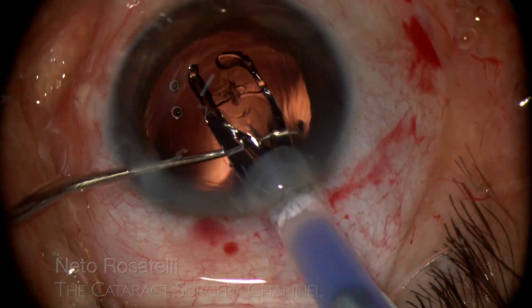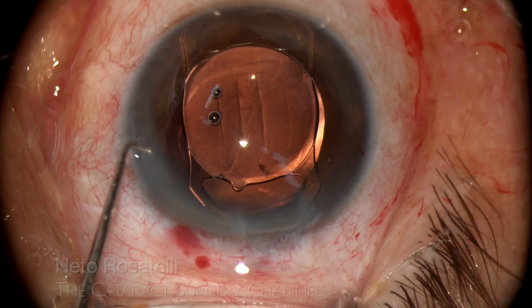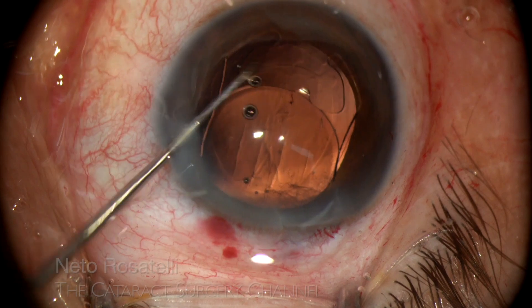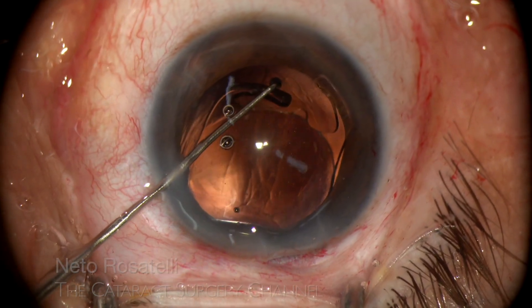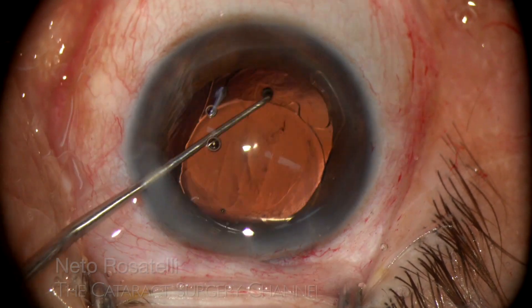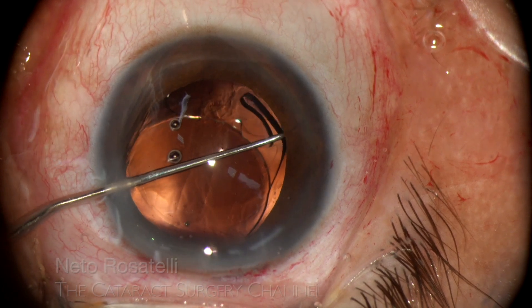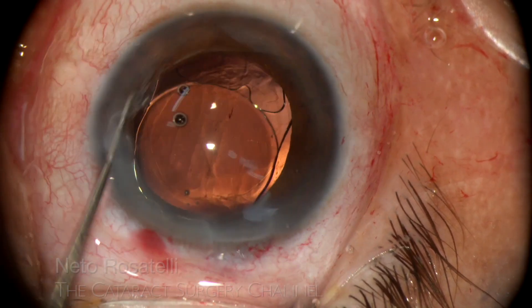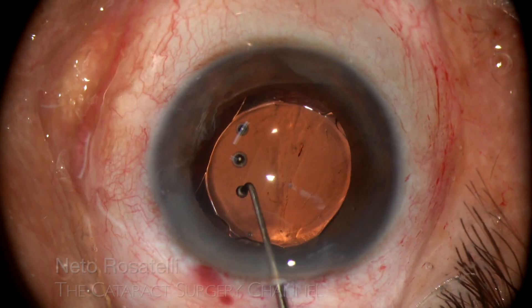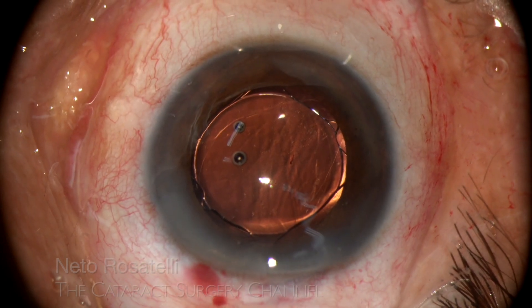This is a hydrophilic IOL. I prefer to place it first in the anterior chamber and then carefully tuck the haptics one by one. Some trial and error is common and one must be sure that in the maneuver the posterior rhexis margin doesn't get caught. I take advantage of the rhexis border to delicately fold the haptics and guide them in place, ensuring correct placement.